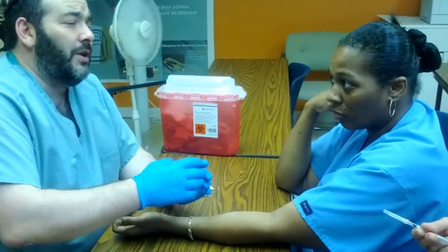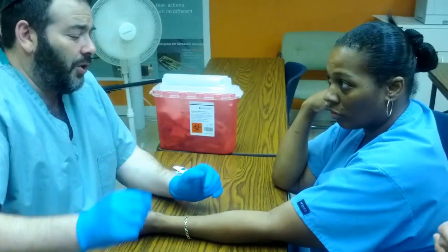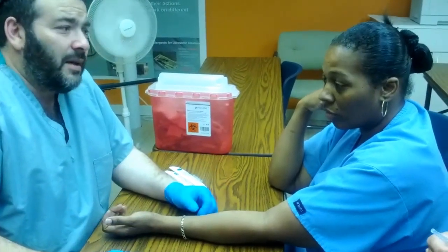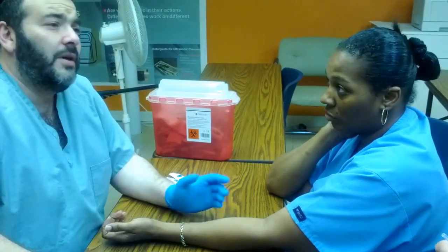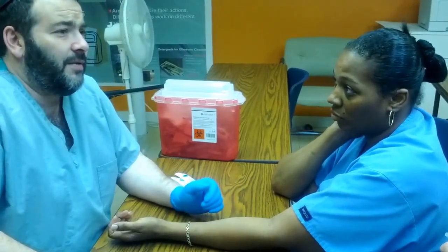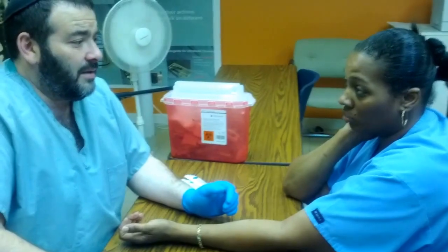Bubble is going to be quite large, and you don't want it to extend past the circle that you drew. Make sense? And you're going to ask them to come back within 48 to 72 hours to make sure that they have a positive or a negative reaction. Does that make sense? Perfect.